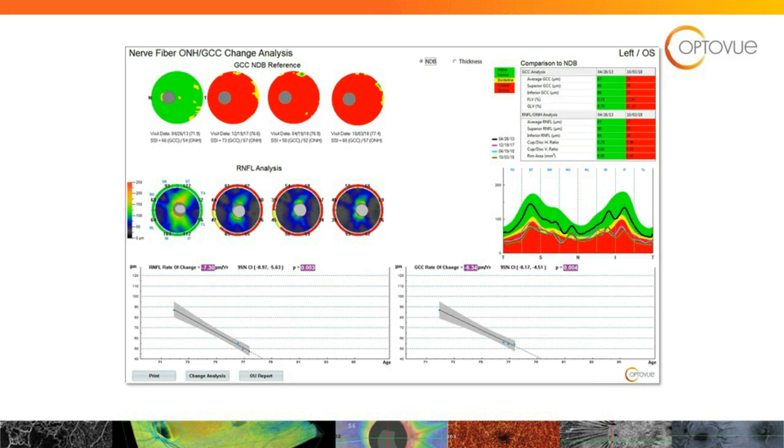So at this point, we've gone through all the questions. I appreciate your time on this. I've made my life's work to make it easy for all of us to interpret this. We know there's so much data happening within these.